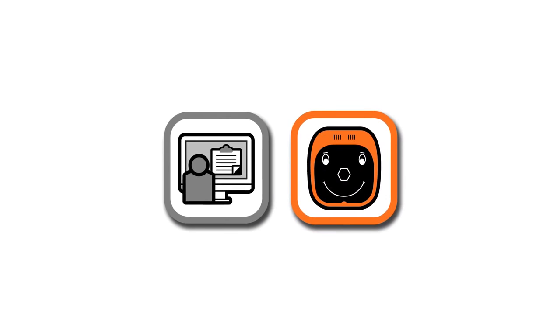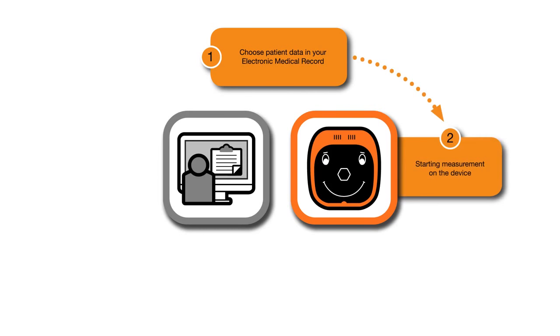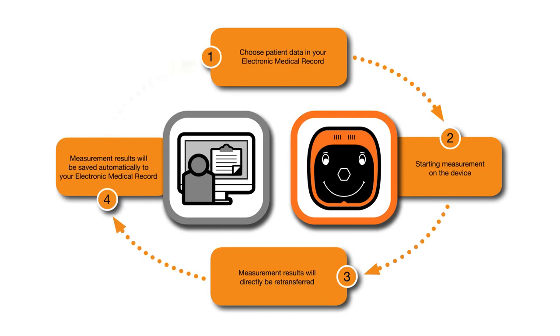As an alternative to the manual entry of the patient data, the plusoptiX S12C can also be connected to your electronic medical record for CSV data exchange and screening report printing. In this case, you simply choose patient data in your electronic medical record and transfer it to the plusoptiX device. After starting the measurement on the plusoptiX device, all measurement results will directly be retransferred and finally saved automatically to your electronic medical record.